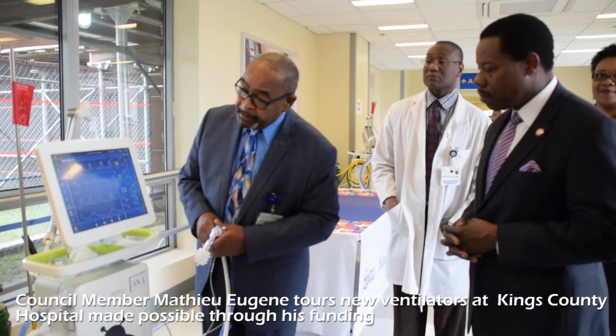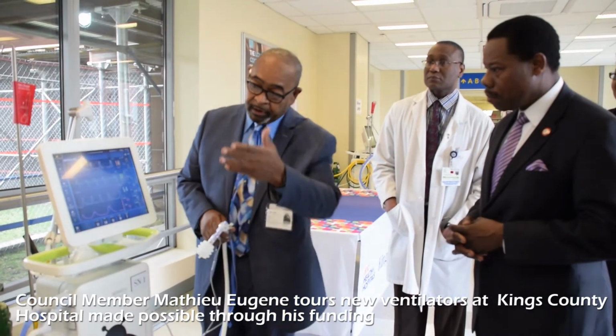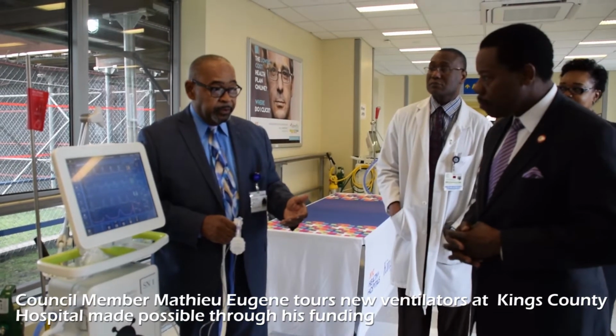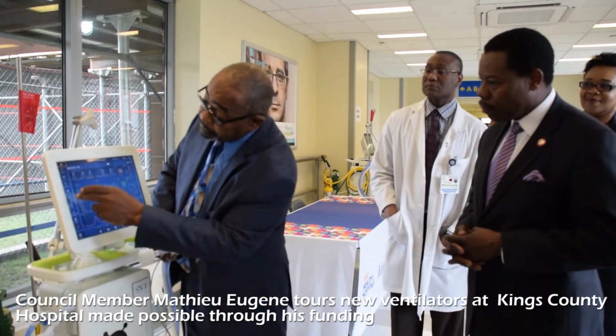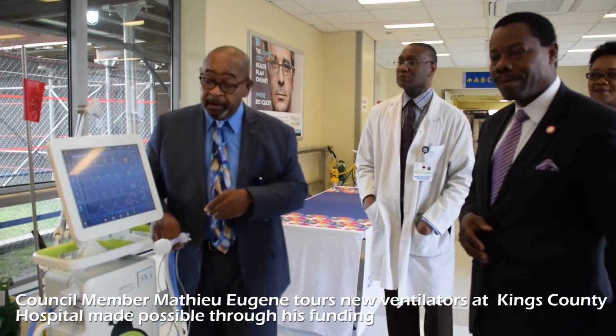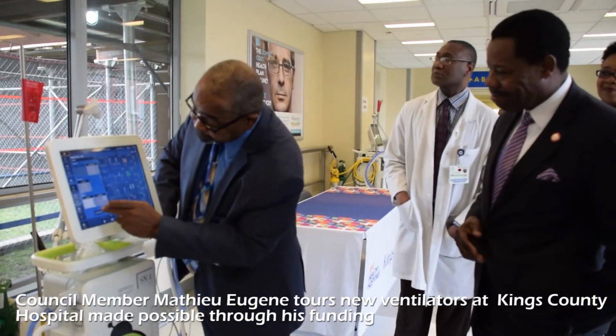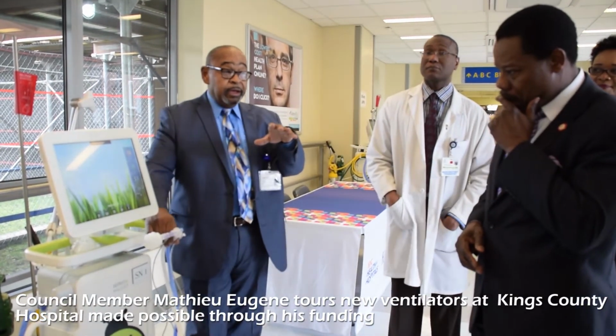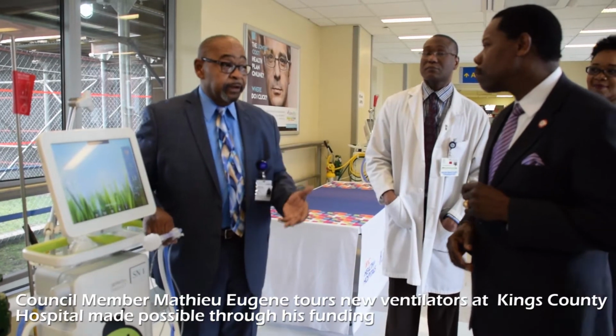So pretty much everything else, Mary talked to you about being able to do screen captures. She talked to you about flow volume loops. She showed you all the views. The other thing, and I don't know if Mary mentioned this, I didn't show the family view. Okay, yes. This one, family view, is designed to try and minimize the family's anxiety.